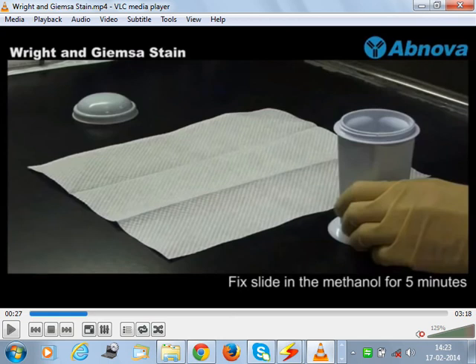Smear with the slide. You are attaching what with what? Slide irukku. Slide ku mela there is blood. Correct? Which you have smeared. Why should we attach the blood to the slide?